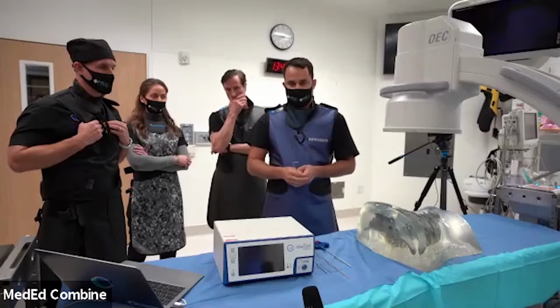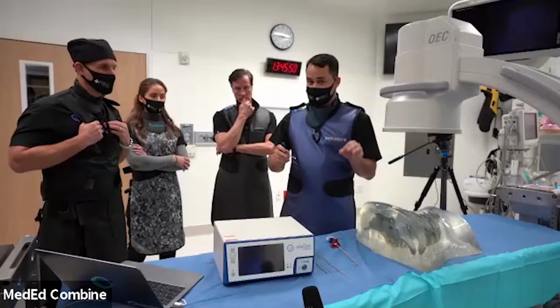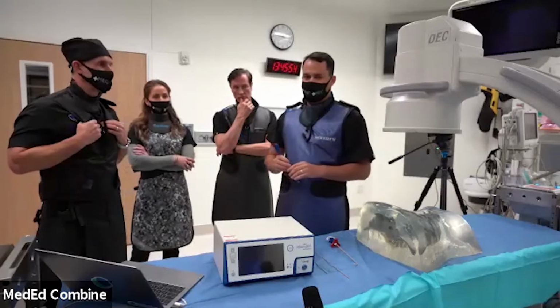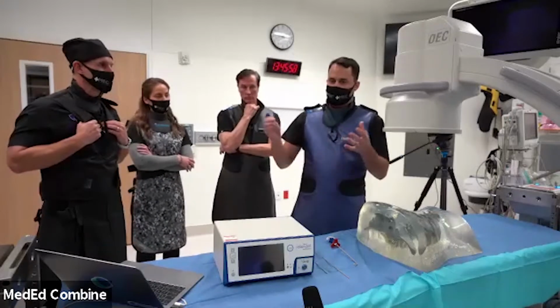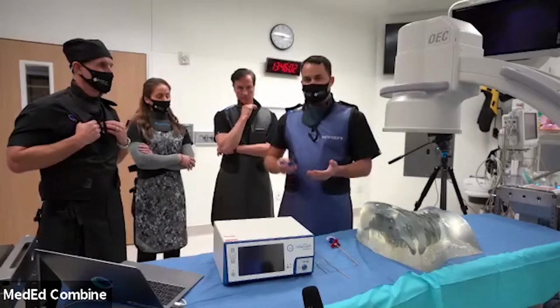the vertebral body. Now, when we're doing a kyphoplasty, which this is very similar to when you start, we're just trying to get into the middle of the vertebral body, right? And actually, we go all the way anterior, right? We always go all the way anterior. We blow up the balloons. We put the cement in, maybe pull back a little bit. But with Intracept, you have to be perfect.